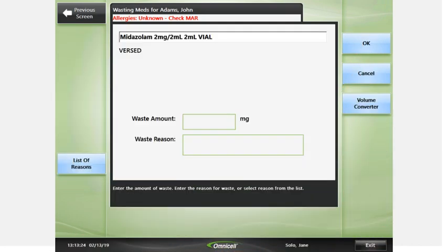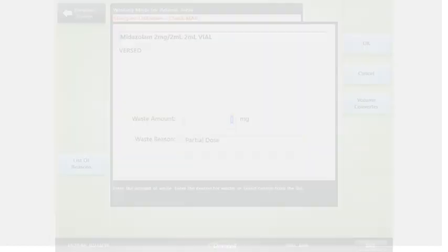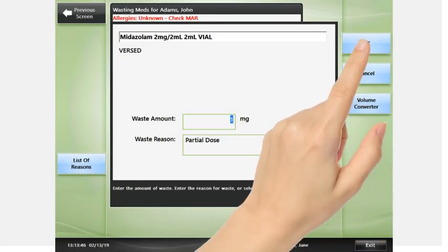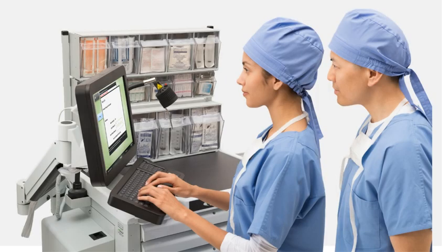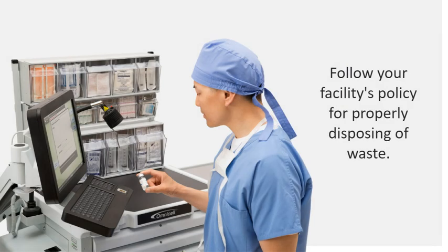Enter the waste amount, then enter or select a waste reason and press OK. Have your witness enter their user ID and password if requested. Follow your facility's policy for properly disposing of waste.